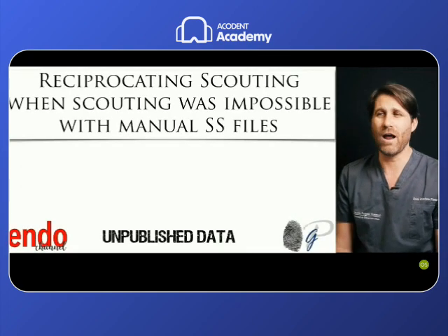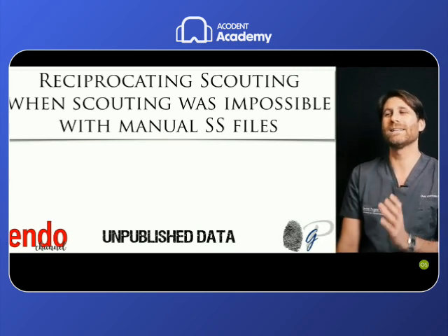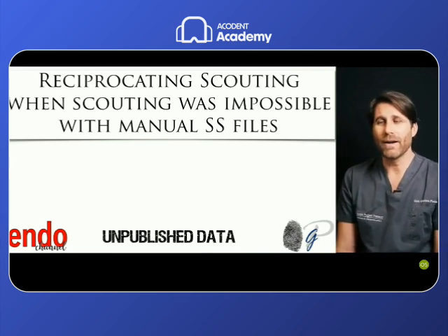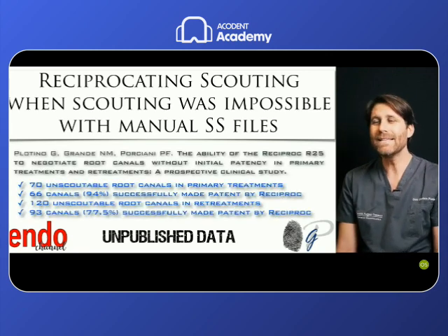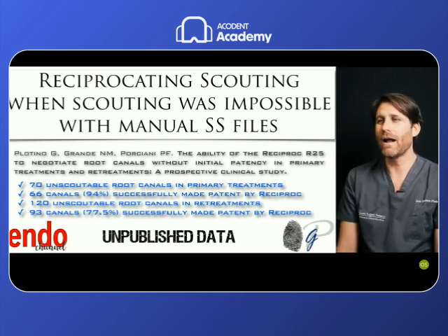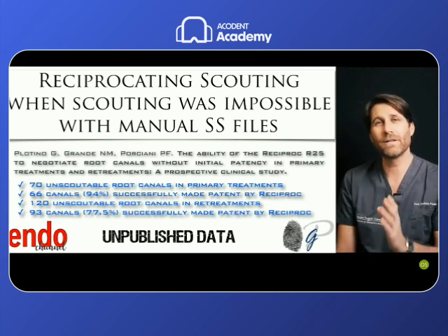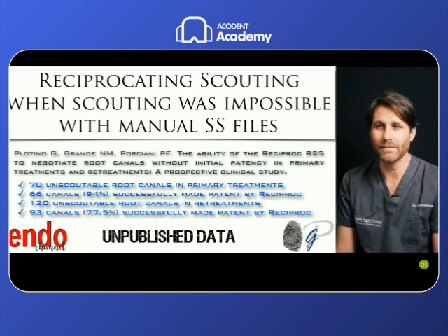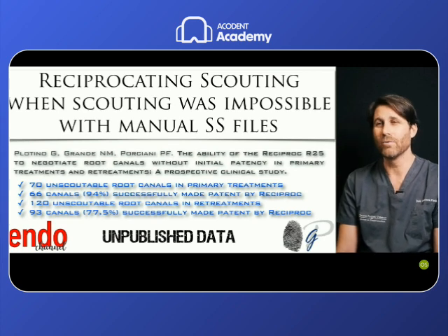I have similar numbers in my clinical practice with reciprocating scouting when the scouting was impossible with manual stainless steel files. So the same situation: coronal preparation, middle third preparation, then the apical scouting was not possible. In these numbers made with my partners Nick Grande and Pier Francesco Porciani, 70 unscoutable root canals in primary treatments, 94% of which were successfully made patent by the Reciproc file in this study. So 66 of 70, the same percentage as the Reciproc Blue study by Gustavo de Deus.